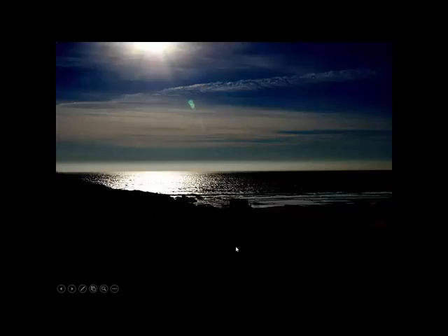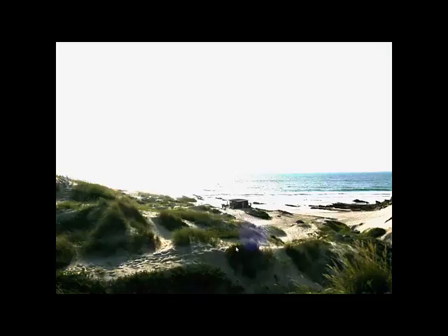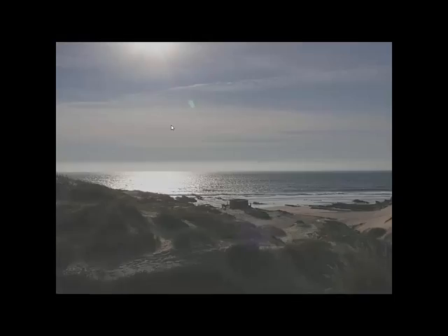If we would now move our window into the black area, we see all the information that we could not see in the black area before. So the darker area of the image is nice, but now the price that we have to pay is that in the white areas there is nothing to see anymore. This would be compressing. Now we see that we really threw away gray levels. There is no clipping. We see every detail, but this is not a nice image. It's much too flat, it's much too gray, and nobody would like to use this one.